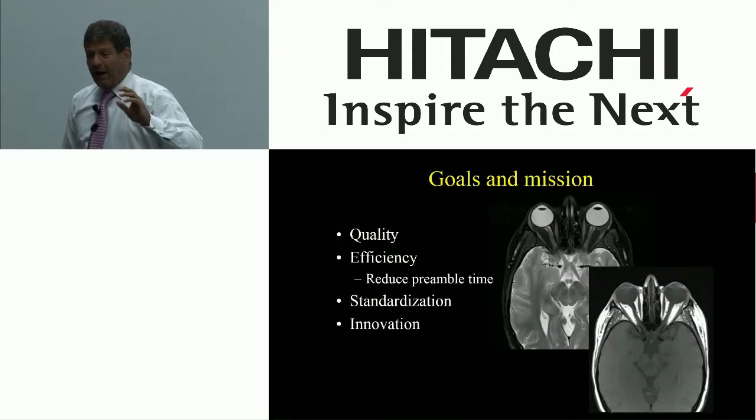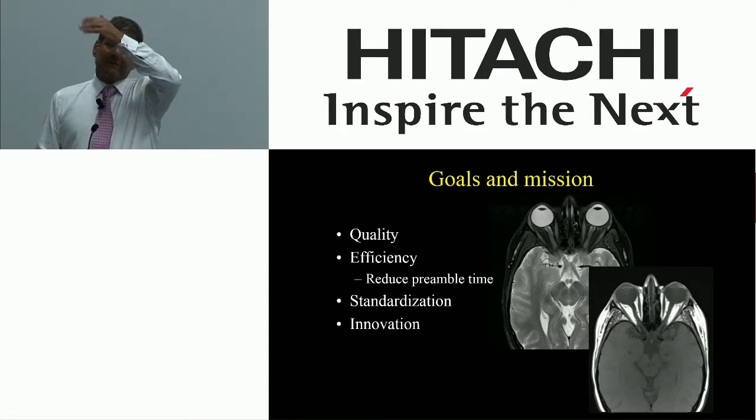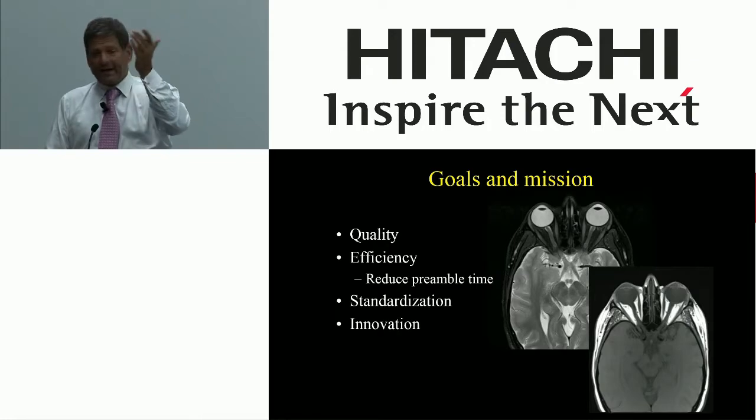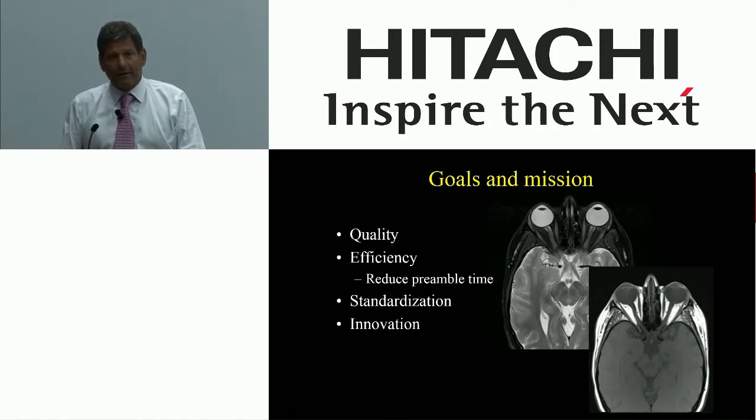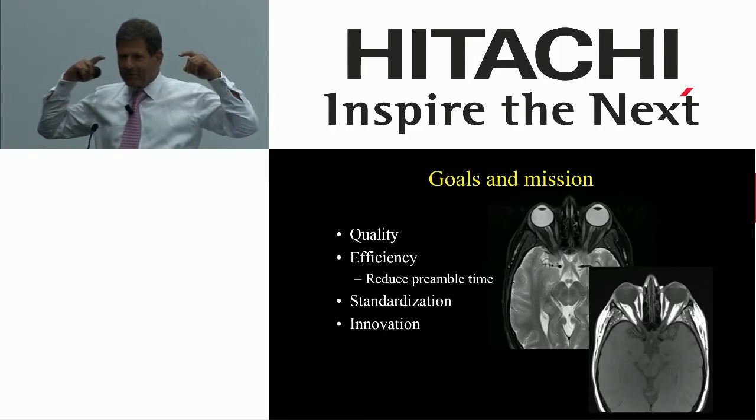But there are other ways that we lose time. I walk in there sometimes and I watch the operation, and I'm a little bit of a nervous guy, and I'm watching the technologist, a very nice man, putting a patient on the table, and he's got a nice little good long conversation going on there before the patient lays down. And part of this long conversation, which can last enough time to send me to grab a scotch, is getting the earplugs set up. You know, the earplugs, they take a while, right?